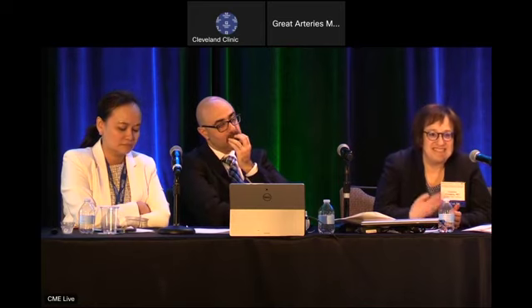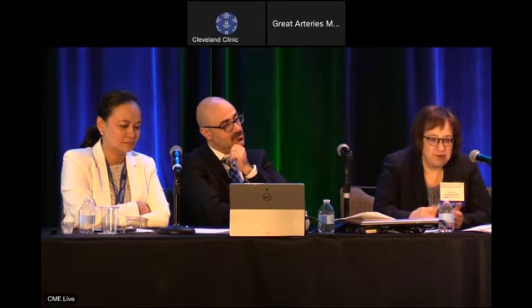So as you're mentioning, they're like 5 minutes out and we snatch them from the neonatologist and can do our imaging before we've had a chance to allow that left heart to load, as opposed to, like you said, when they were 2 or 3 or 4 days old and we made the diagnosis at that time.